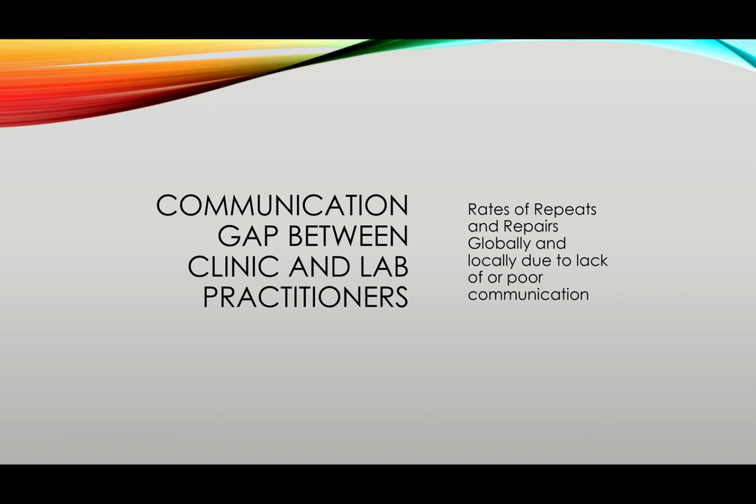Just don't be limited and know that you have options. That by itself is a big accomplishment, to know that you have options. You don't have to do the same thing the same way all the time. You can say, give me a core, I will layer. And then the next case you can say, just give me monolithic and I will stain it. And then, give me monolithic with buccal cutback. And then, give me monolithic and I will do a micro cutback and a micro layering. And then, give me a core and I will layer the whole case. It has many characterizations that need to be established in layering. Fine. But know that you have options and you can pick and choose.